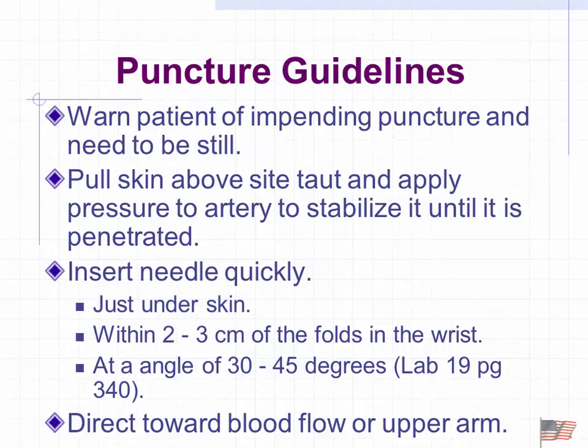30 to 45 degrees. Now, it probably doesn't make a difference clinically, but in our mind, the bevel of the needle should be facing the blood flow. So in other words, I'm going to go this way rather than this way. Does it matter? No, the artery's got pressure in it. It's going to fill either way.